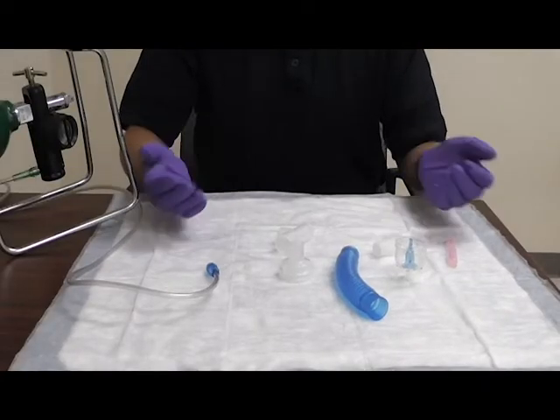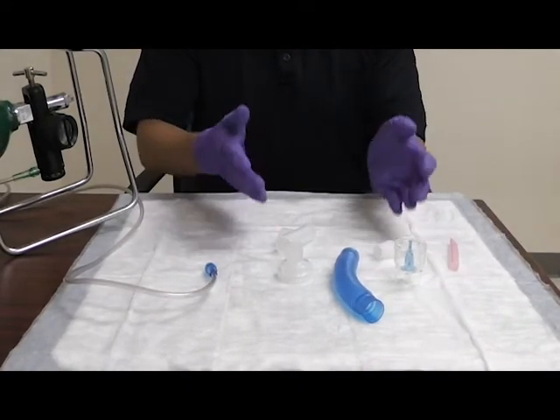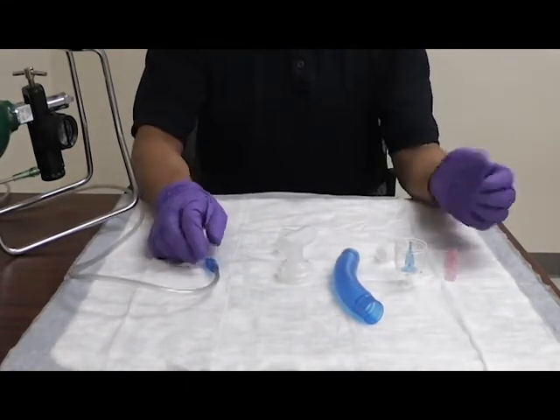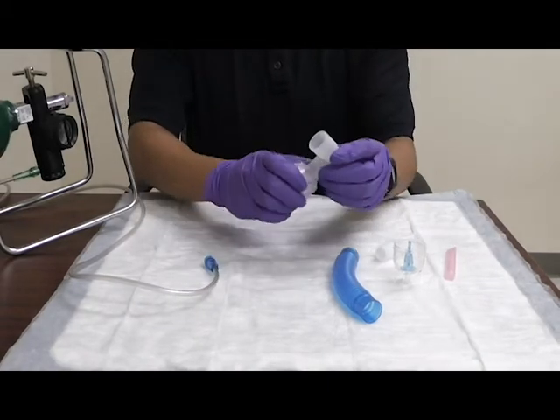This is the proper assembly of your nebulizer unit for inhaled medications. You'll need your nebulizer unit, your O2, and your medication. To properly assemble your nebulizer, you'll first attach all the parts.